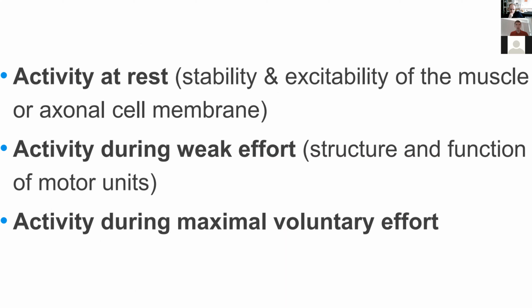The structure and the function of the motor units have distinct features in myopathy and polyneuropathy. However, the same discharges of hyperexcitability might occur in both conditions. So of important value in the discrimination between a myopathy and a neuropathic condition is the recruitment pattern.